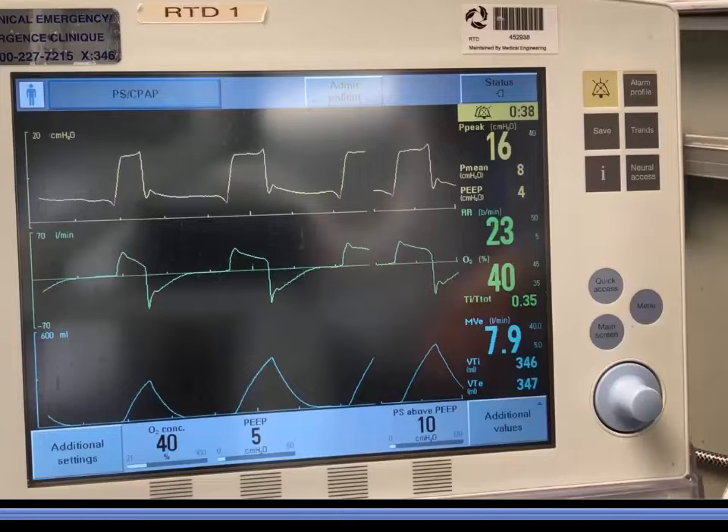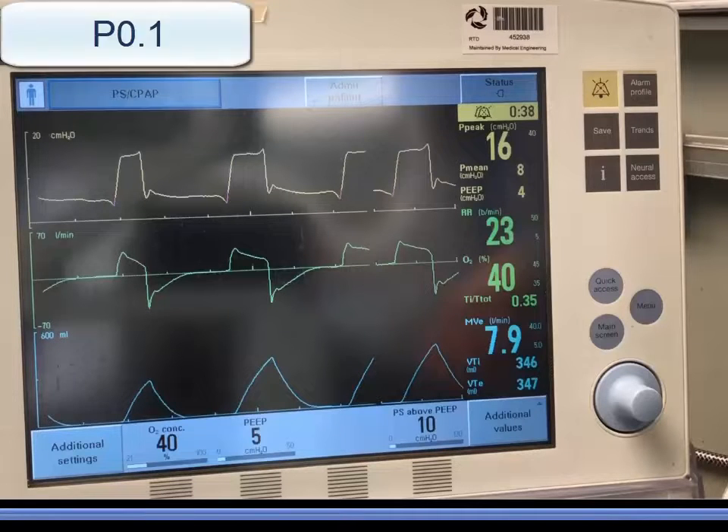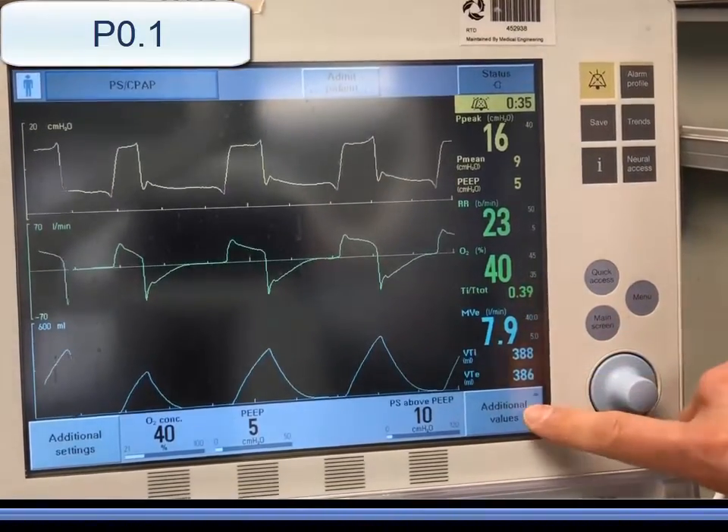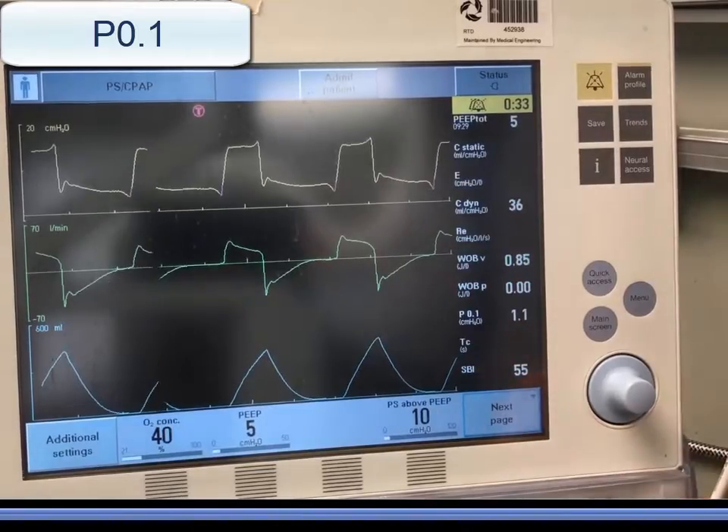To begin respiratory effort monitoring on the Servo-i, P0.1 can be found on the third page of the monitored values and is displayed breath by breath.